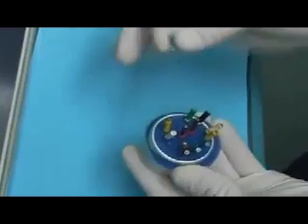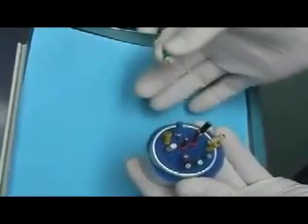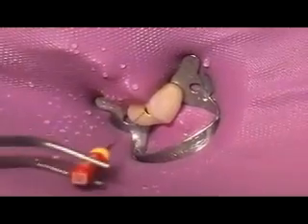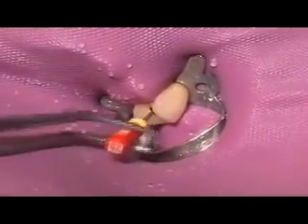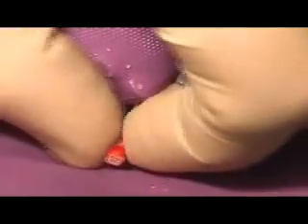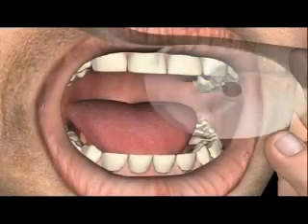With the aid of sterile instruments, the dentist can begin to clear and clean the interior of the tooth. Special solutions are used intermittently for rinsing in order to remove tooth chips, cell debris, and bacteria. It's important that all canals are reconditioned. Most teeth have several canals. 3 of them are shown in this image, and the instrument is placed in one of them. Therefore, a precise and cautious dentist always works with magnification, such as medical magnifying glasses or even a microscope.